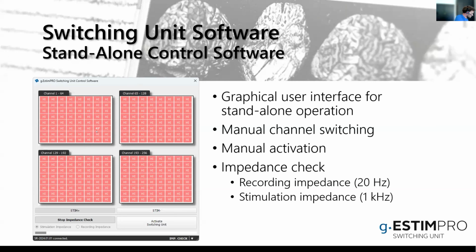So I put this into the saline and I will connect the electrode head box to the first group. And you will see, whenever the impedance measurement arrives at the first group, then hopefully the impedance will turn low for those channels which are good. Exactly. So here we have very nice low values for the impedance, except for a couple of channels which are obviously bad. So this is very important, because now I know that I cannot stimulate channel 14 and 23, because for some reason they are either broken or they are not connected properly to the patient's brain surface.